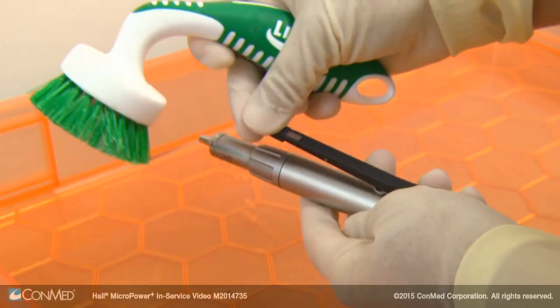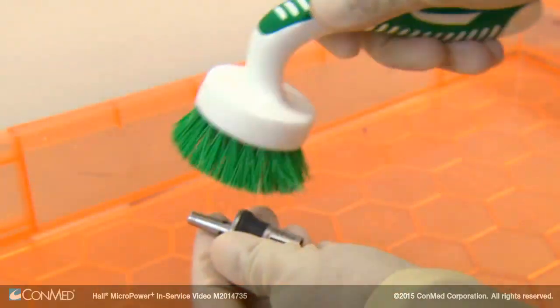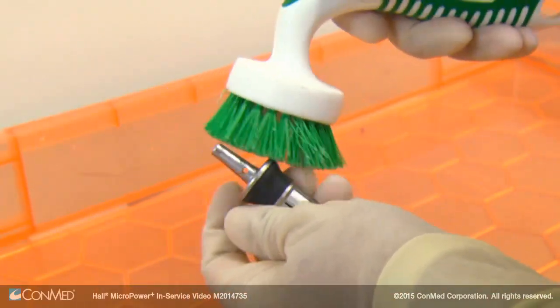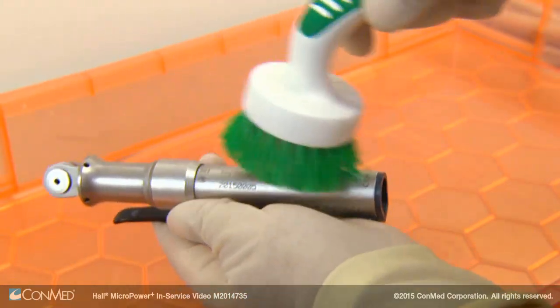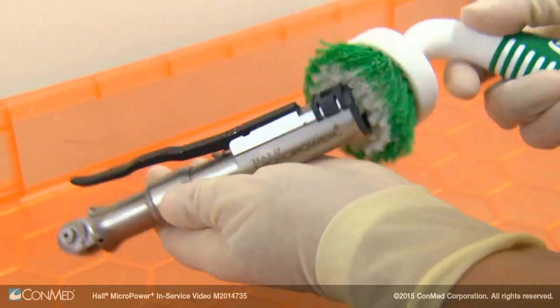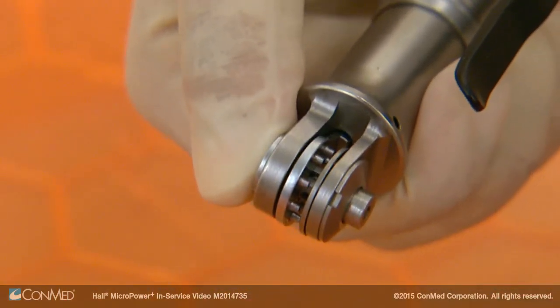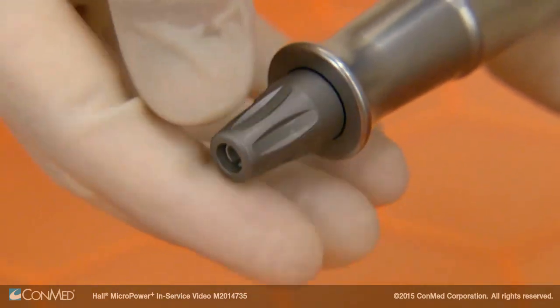Thoroughly scrub the handpiece, handpiece cord and attachments with a clean soft brush dampened with a mild pH balanced detergent. A neutral pH detergent less than a pH of 10.5 should be used to prevent corrosion. Ensure the blade locking collet on the sagittal oscillating and reciprocating saw is in the open position.